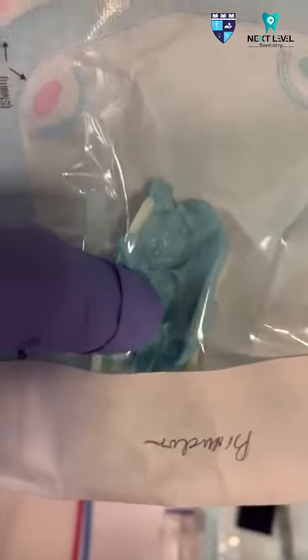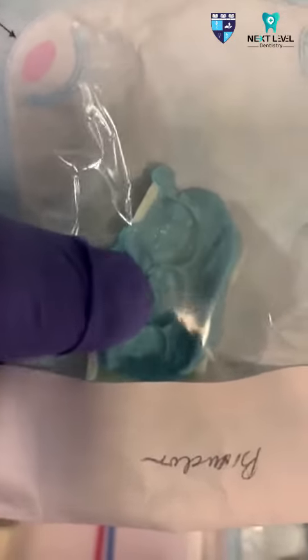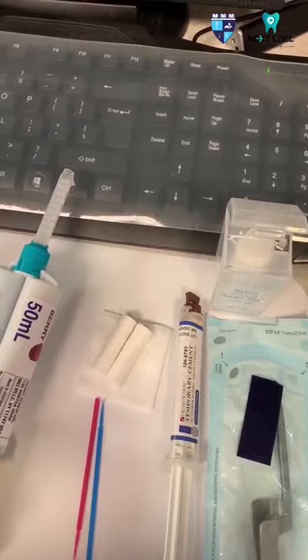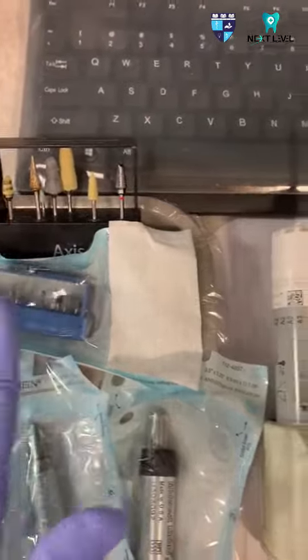We prep tooth number 19 on this area. In making a temporary crown, we have to fill this area with a temporarization material and let the patient bite on this for 2-3 minutes until the material has hardened. If you already have the temporary crown molded from this, we should adjust all the contacts to bite the occlusion with this burr.